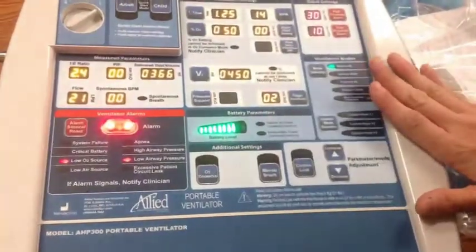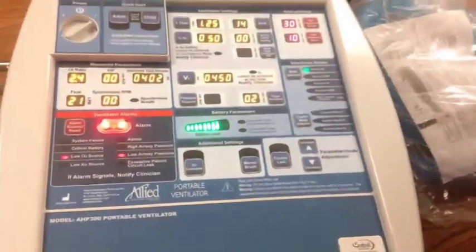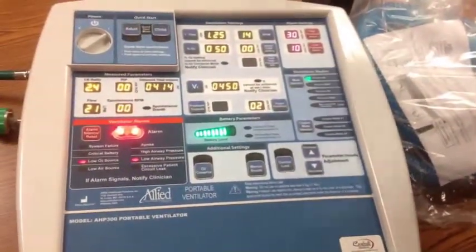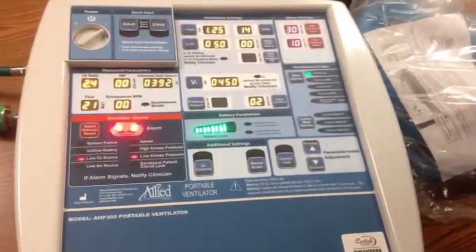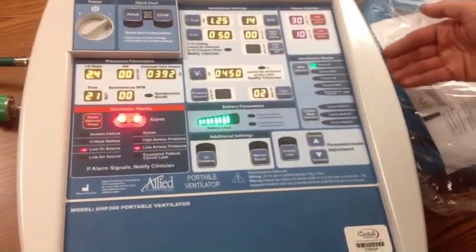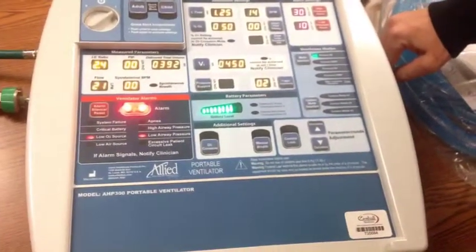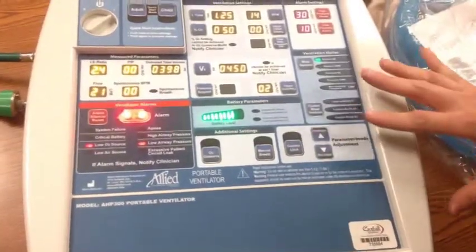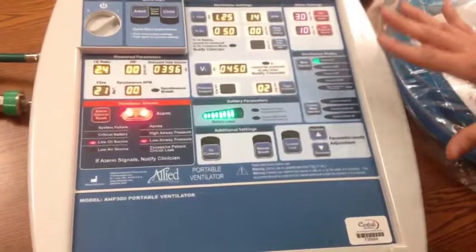Once you have all of your parameters set, you can hook in your device, either your pediatric circuit or your adult circuit, and it'll automatically begin delivering. If you can hear it now, it's actually delivering the breaths as we're speaking. So there's no start button, there's no pause button on this, which makes it nice and easy to use.